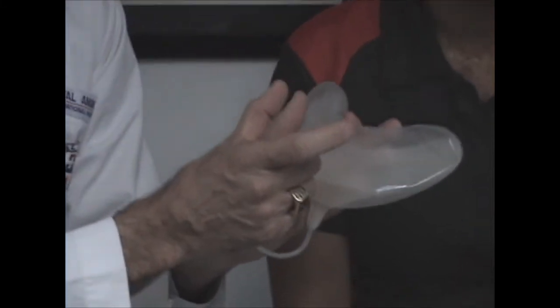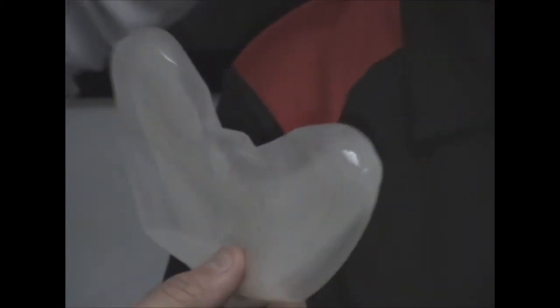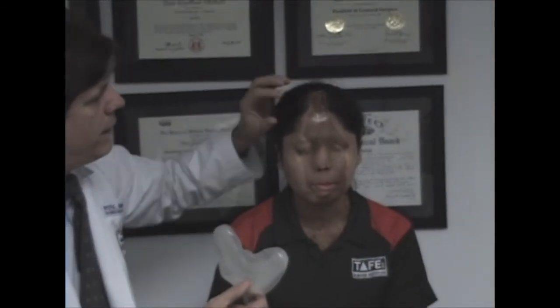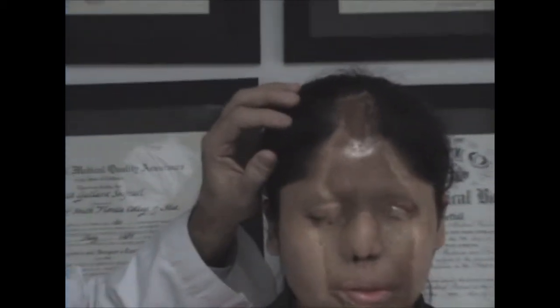And what we're going to do is insert tissue expanders. And this is an example of a tissue expander. This is much larger than we're going to use today. We're going to use something very similar but smaller, about this large. And we're going to make incisions here and put the expanders underneath her galea, which is a structure in the scalp tissue. Underneath her galea, we're going to place tissue expanders on both sides, one here and one here.